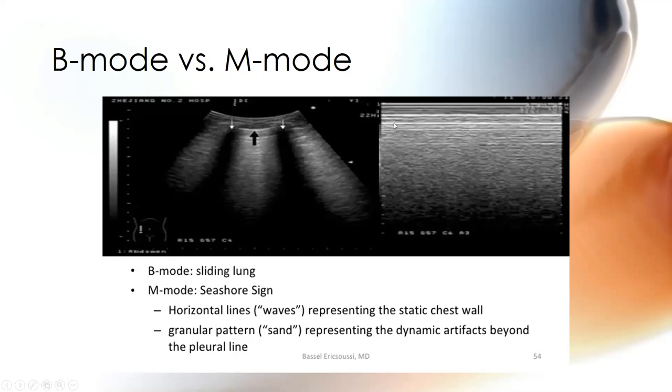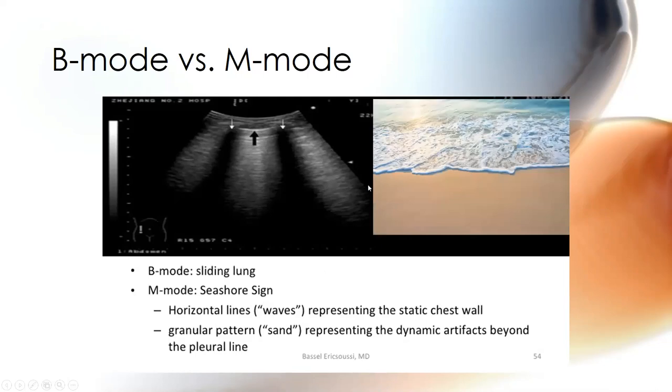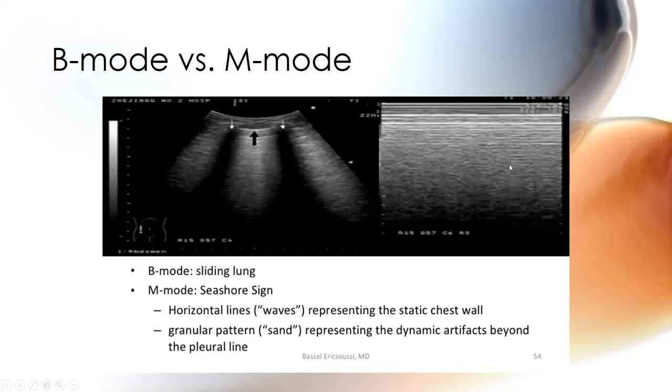But I can clearly see a distinction between this and fuzz McFuzzies, okay? Fuzz McFuzzies makes me think that artifact is happening because lung is moving. And so what they will call this is the seashore sign. So you're going to look for a seashore. You're like, what seashore? I'll show you. Okay, everybody wants to be there right now. But what you're looking for is a seashore and a sandy beach. Sandy beach is all of this. Seashore is looking out that way. So you're sitting here looking out towards the horizon. So the waves, which is not wavy, but it's like straight across waves, that is the chest wall not moving.